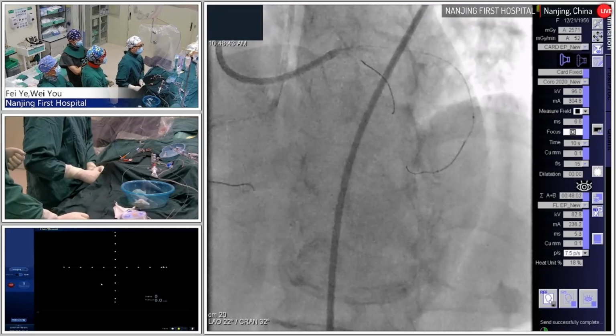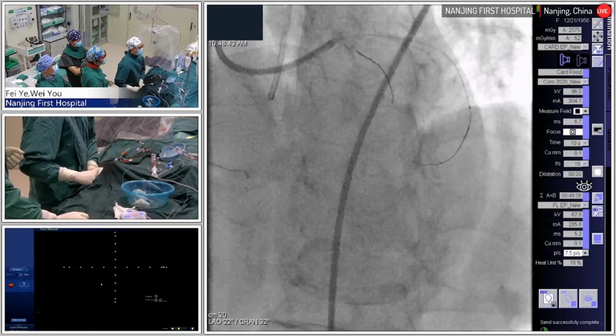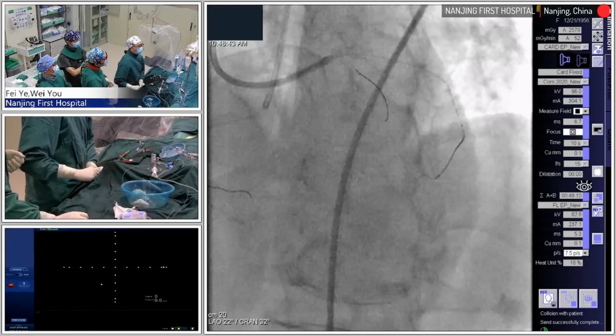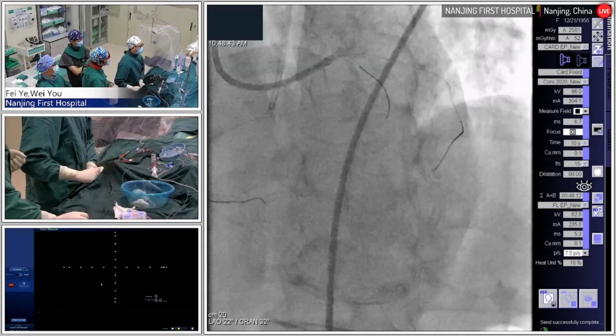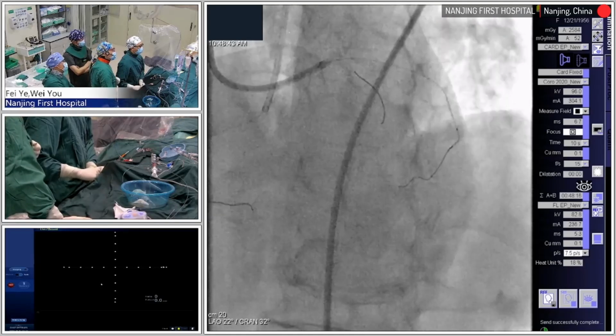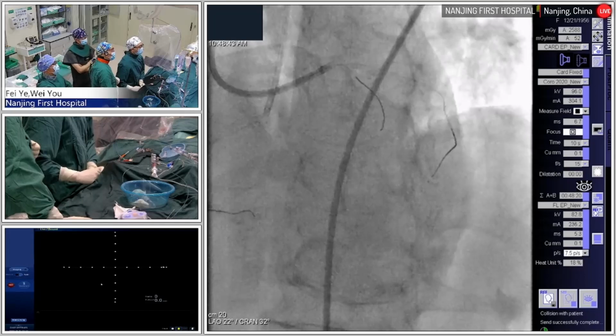Still back, still back. The wire is back. Then try the same branch. It seems like the same channel. Maybe the same branch.